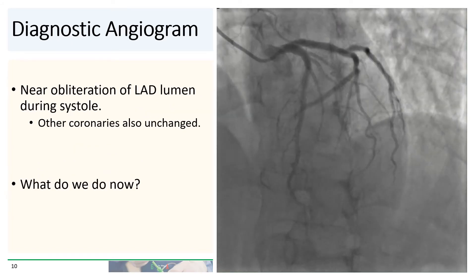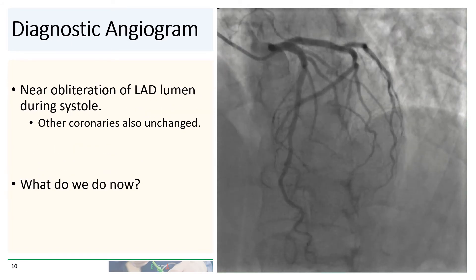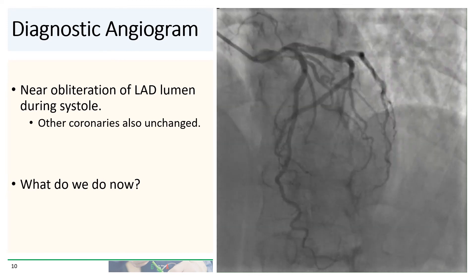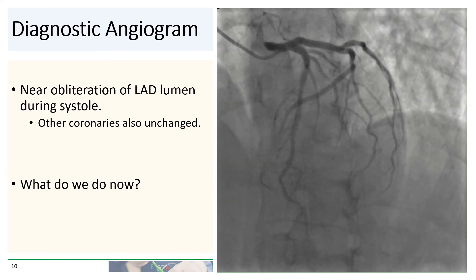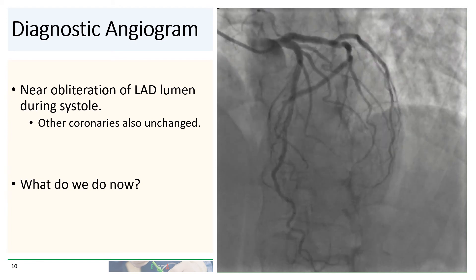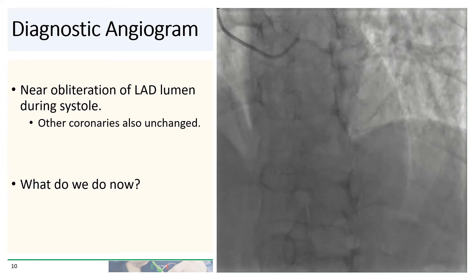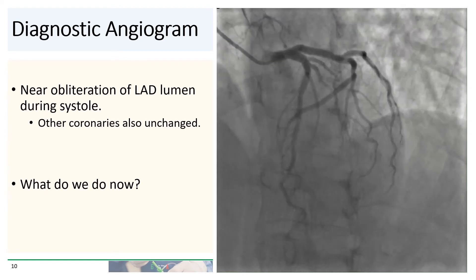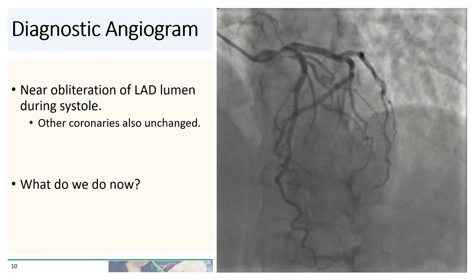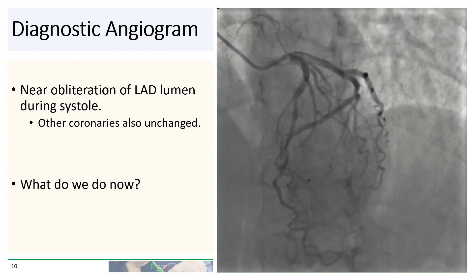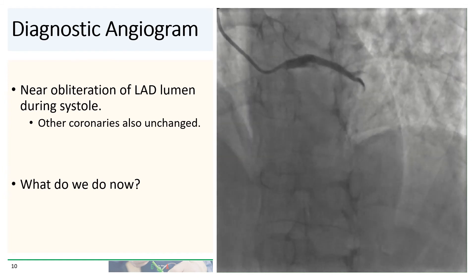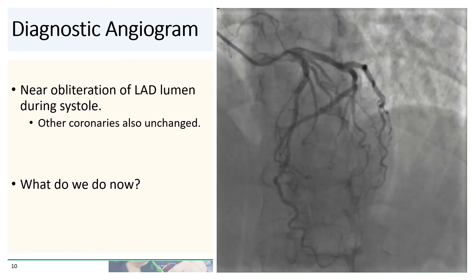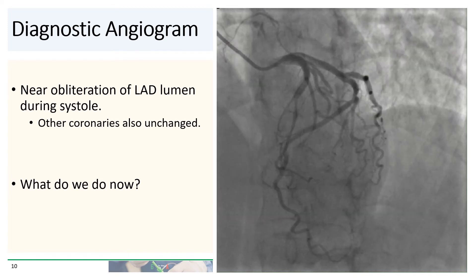On relook, her coronaries are essentially unchanged. Again, we see the long myocardial bridge with near obliteration of the lumen of the LAD during systole. So what are our options now? This patient is already on fairly aggressive medical therapy. Is there an invasive option? Can you stent a bridge?